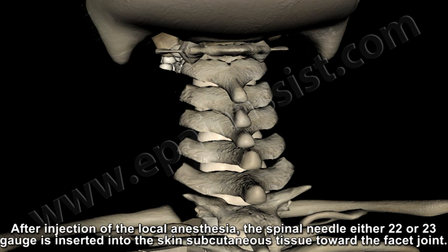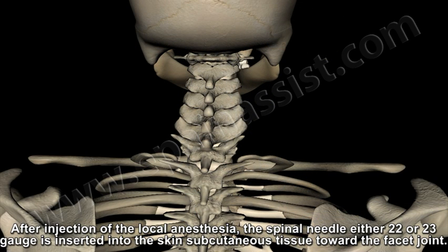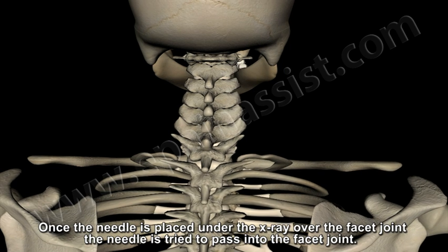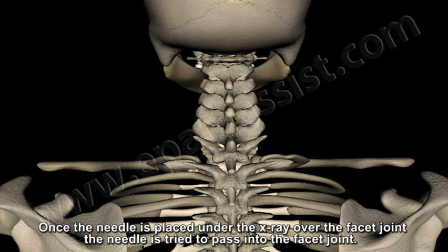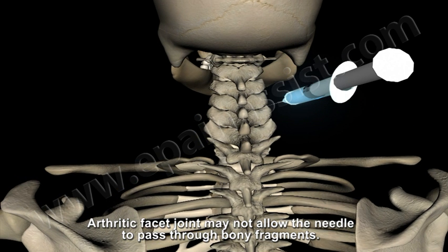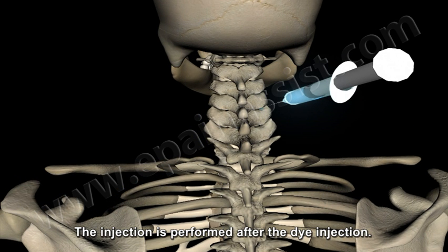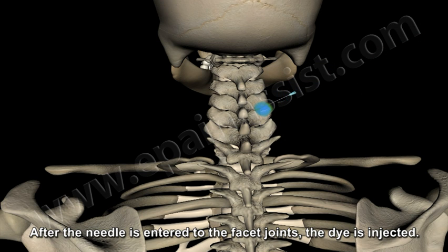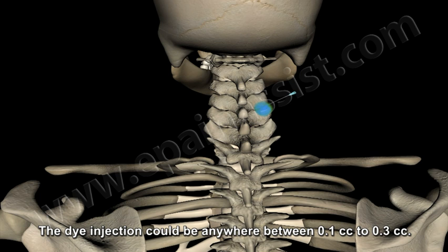After injection of the local anesthesia, the spinal needle, either 22 gauge or 23 gauge, is inserted through the skin and subcutaneous tissue towards the facet joint. Once the needle is placed under the X-ray at the facet joint, the needle is tried to pass into the facet joint. Arthritic facet joint may not allow the needle to pass through the bony fragments. The injection is performed after the dye injection. After the needle has entered the facet joint, the dye is injected. The dye injection could be anywhere between 0.1 cc to 0.3 cc.